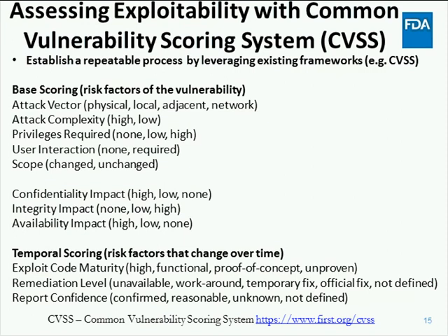And moving to the modified base score, the modified base score takes into account defenses or controls of an organization or product and should be assessed by the manufacturer.